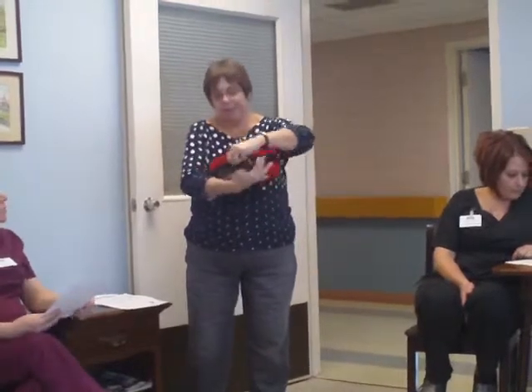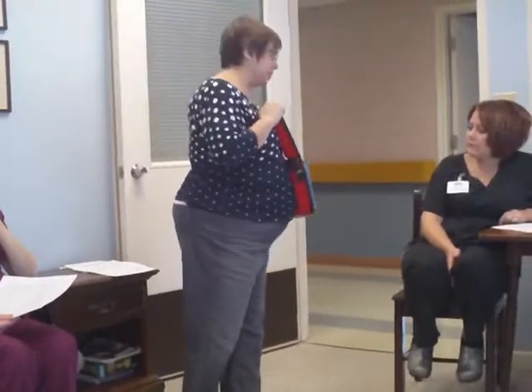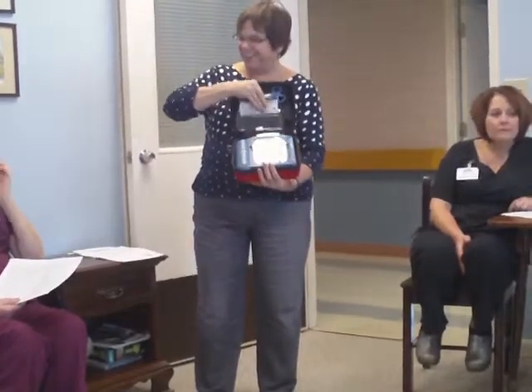So basically, this is a little carry case. It zippers open. Ta-da! It's even got a picture. We like pictures. There's even scissors, you can cut the clothes off people if you need to. Don't use these for bandages. It's for clothing only. Just kidding. Do not use my sewing scissors for bandages, or paper. Don't cut tape with those.